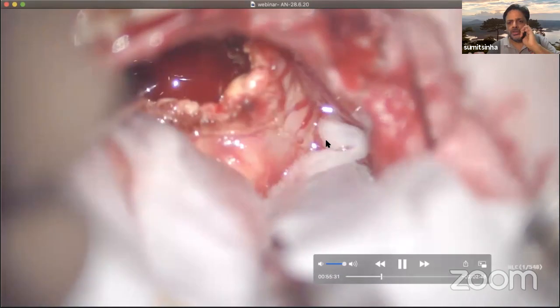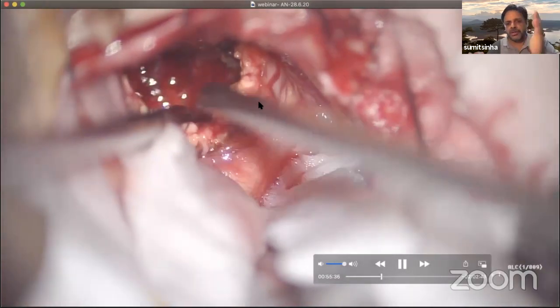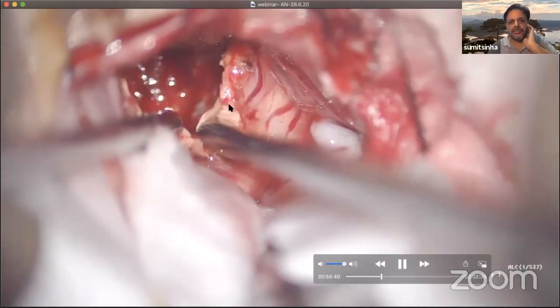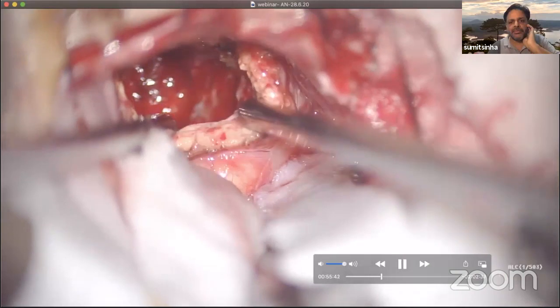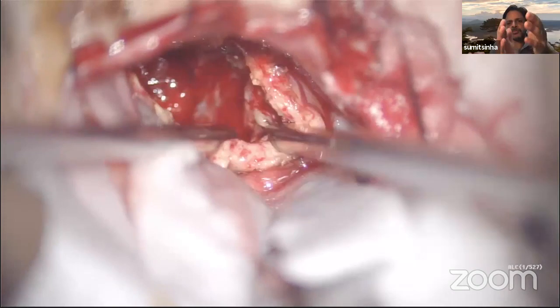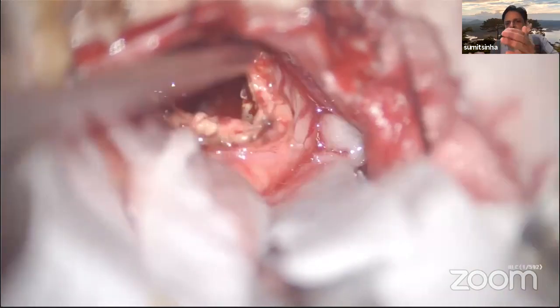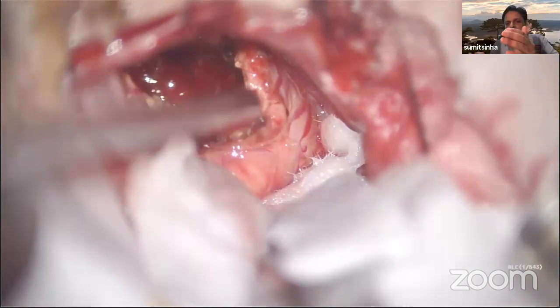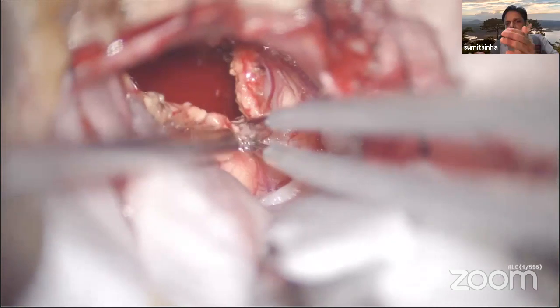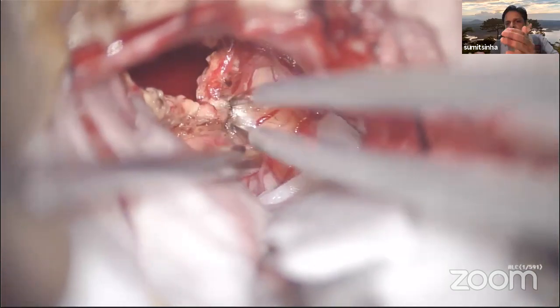Now you have dissected till the limit, and there is a time now that you have to decore it again. You have to make the capsule more manageable. So this is how it goes. It has to be a delicate balance between decompression and dissection. Both of them have to go side by side. Neither process is independent of the other; they are interdependent. So do you understand? Both of these procedures are very, very important. Decompression and dissection have to take place side by side.